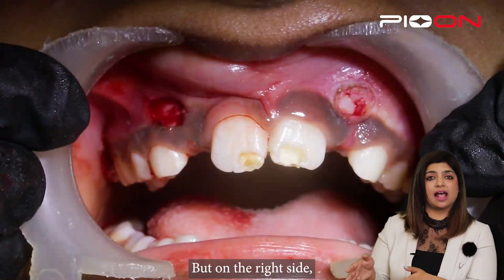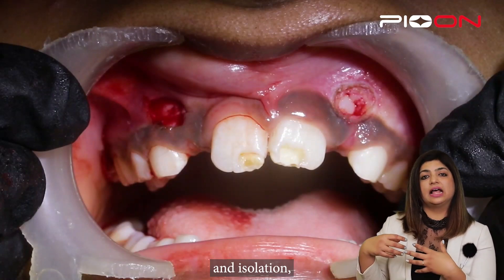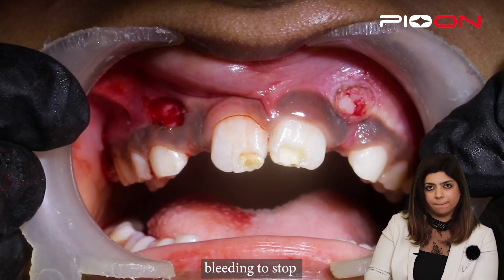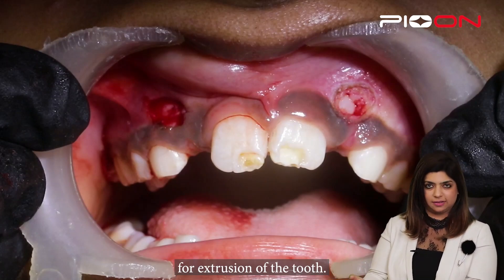On the right side we cannot place the bracket because of the problem of bleeding and isolation. That's why we will wait for the bleeding to stop, followed by placement of the bracket for the extrusion of the teeth. Thank you.